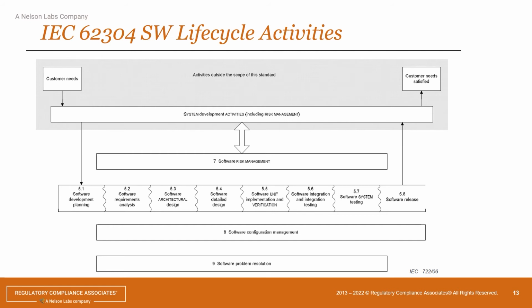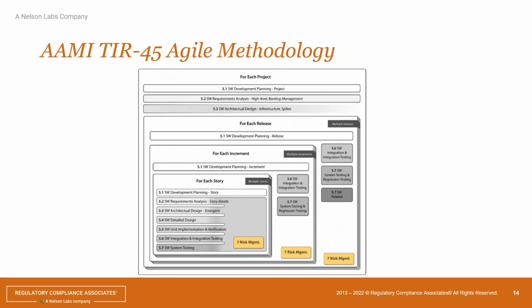Now, when we look at this, it looks like a waterfallish sort of model, but 62304 does not dictate which way you go, and they allow you to do it in any way, shape, or form you want to do, and people use different aspects of how to do this, and obviously one of those is the Agile methodology, and in Agile, basically the idea is that you want to move fast, but for medical devices, you just want to have some level of control in place.